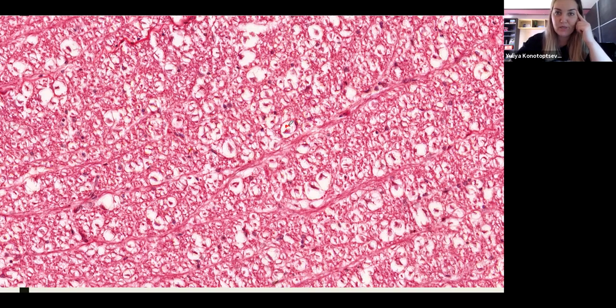I agree with you that we can see lots of axons, but don't forget that in the spinal cord, the gray matter also possesses axons and dendrites. So it also could hypothetically have axons and dendrites. So how do you know that this is exactly white and not gray? No cell body. Perfect. No cell bodies. You do not see any cell bodies. Whose nuclei are these?